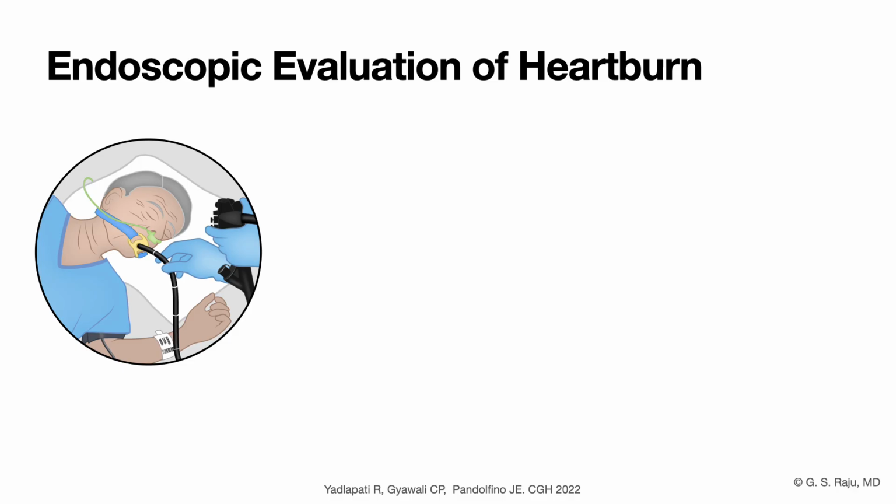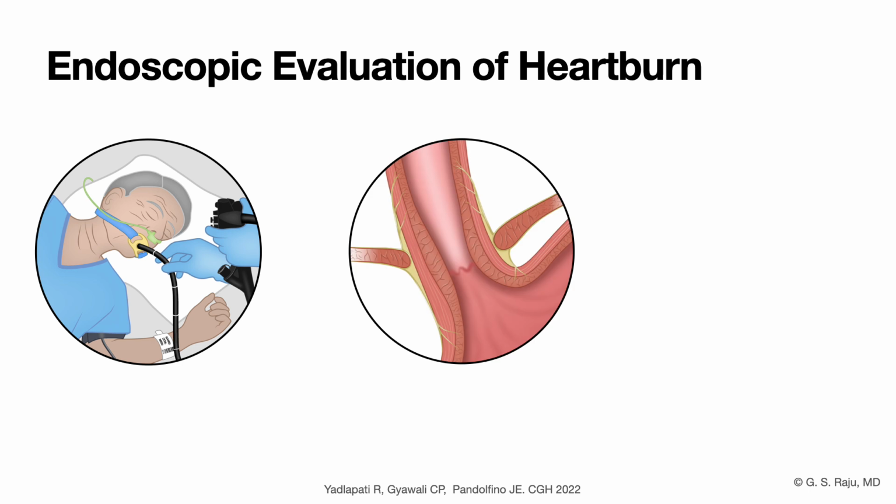When it comes to endoscopy in a patient with heartburn, you should follow certain principles and evaluate the lower esophagus, the crura, and the flap valve.